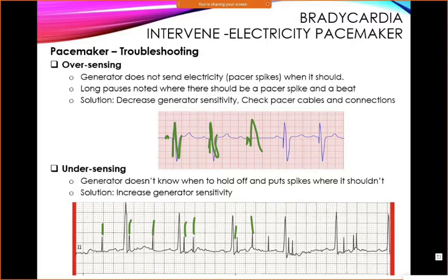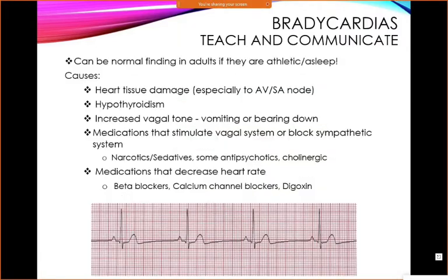And so this is our job, is to make sure that if this pacemaker is leaving long pauses, then it's not doing its job. We need to make sure it's reading properly. And if it's sending electricity where it shouldn't be, then we need to sensitize this pacemaker and make sure that it's not throwing electricity where it shouldn't. So really, I'm not going to spend a ridiculous amount of time on pacemakers because you're not going to be running pacemakers.